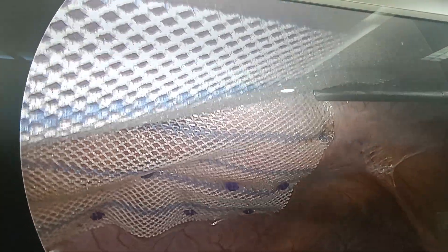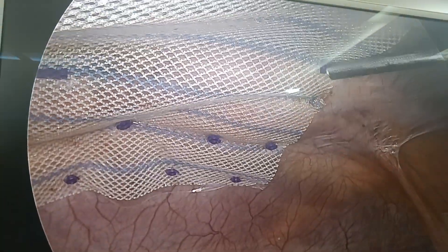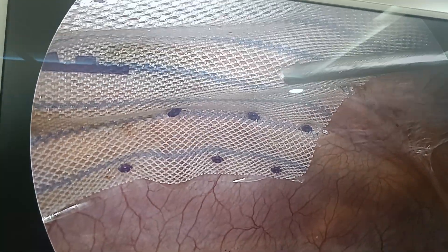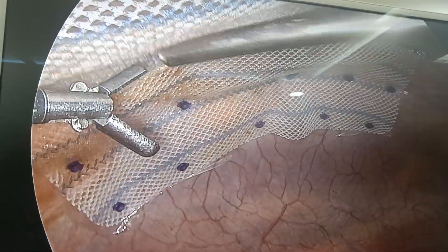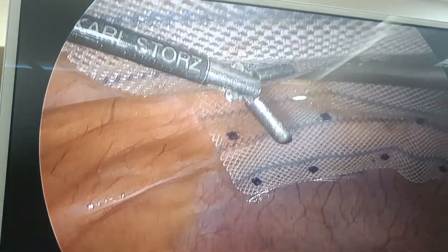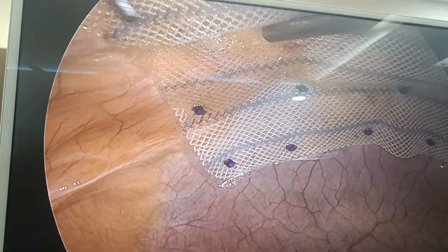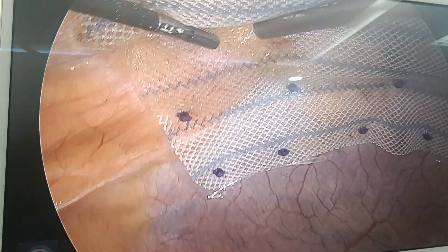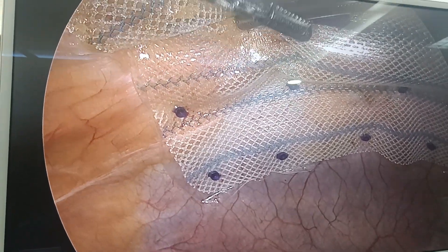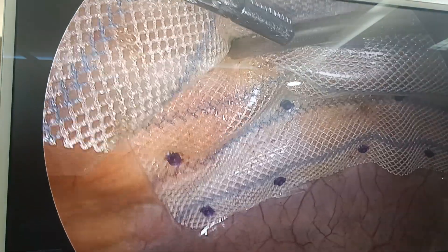I am showing in this video how to put a tacker. You have to apply pressure here — and there, that is how we put the tacker. I am going to put tackers all over the mesh. Just look here: it is not very difficult, you just have to apply counter pressure.